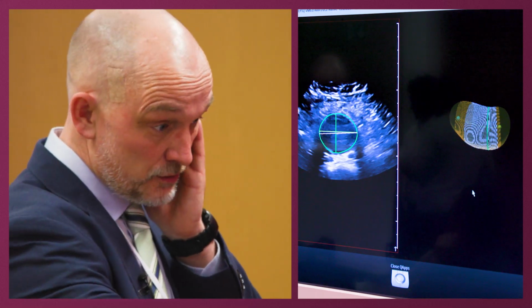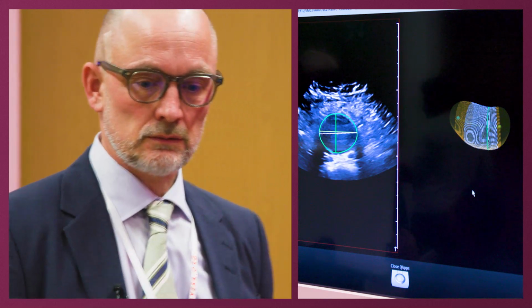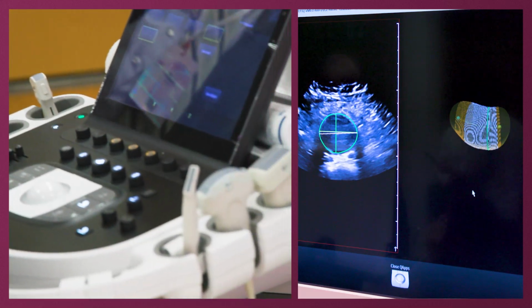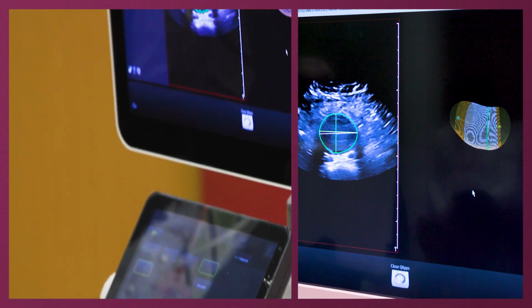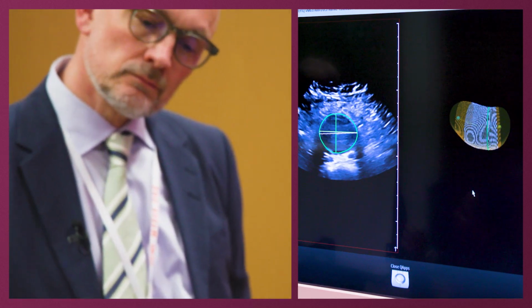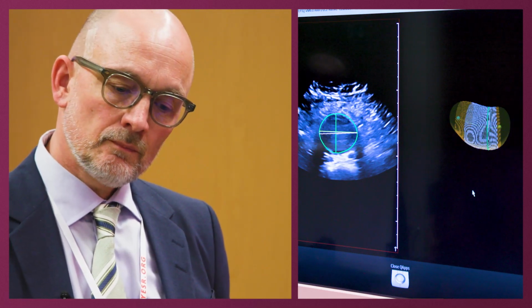Do you have access to equipment like this at home? Yeah, we have the Epic 7. Ah, perfect. I think we also have the transducer. But I think it will be very valuable for us, because we do it as we understand. But for instance, nobody told me, okay, just take the systolic. That's just a short thing that I didn't know, and it matters, right?